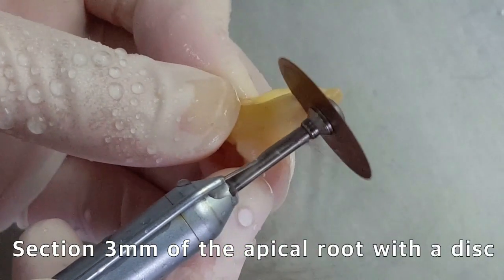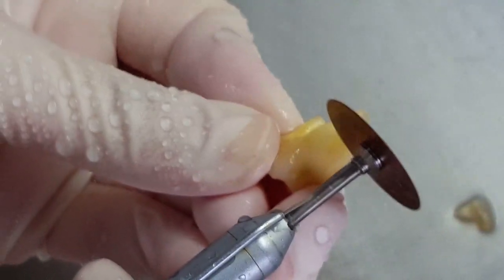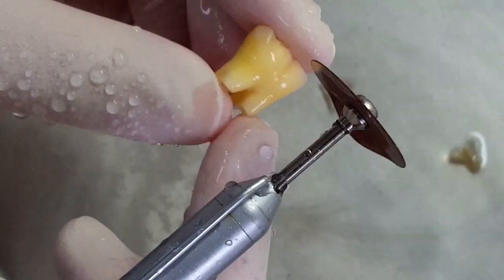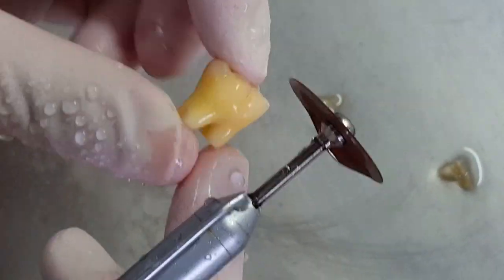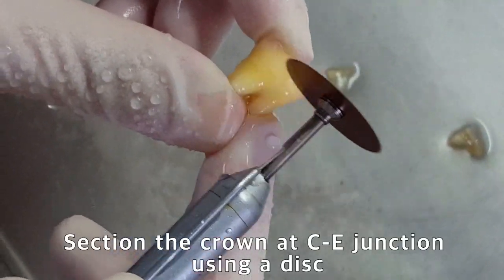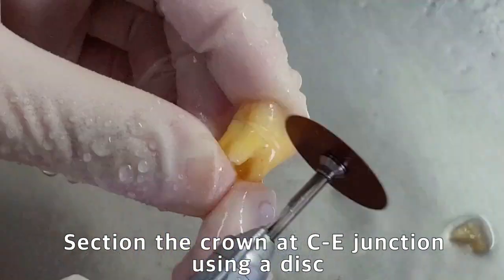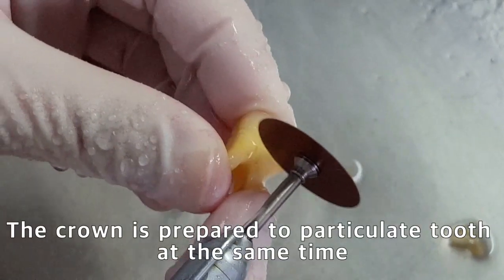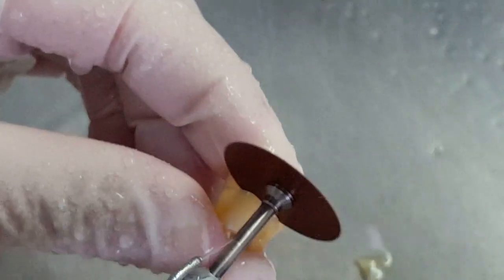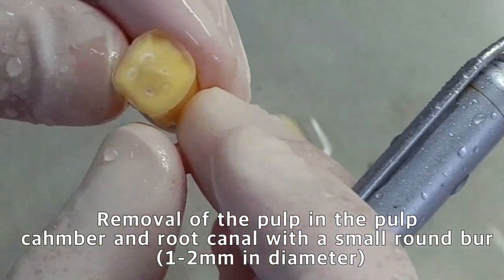Cut about 3 to 4 millimeters of the apical root using a disc. The severed apical root is prepared as particulate tooth bone graft. The crown is also cut at the CEJ using a disc. After removing the pulp in the pulp chamber, the crown is also prepared as particulate tooth bone graft at the same time.